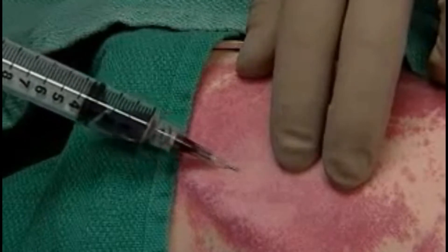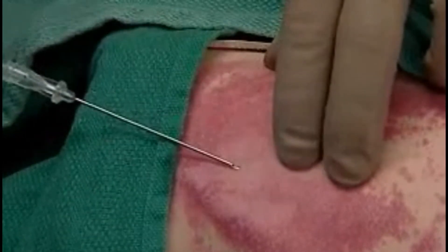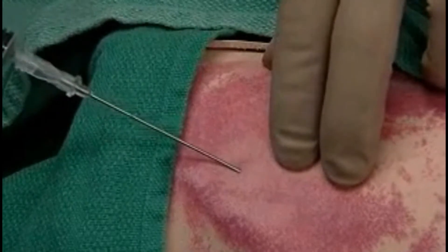You'll withdraw the needle, mentally noting the location and the angle of entry, and re-enter with the Seldinger needle.